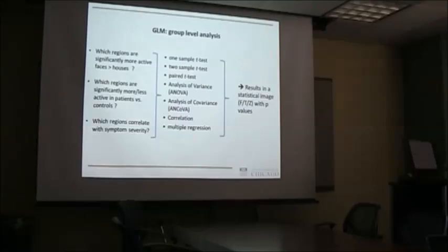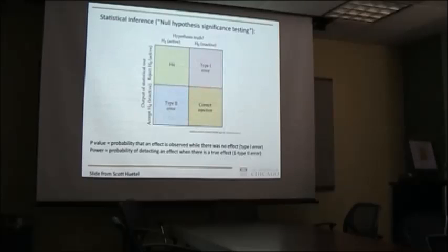And each of the test statistics have their own distribution, and they're related to p-values. Right? So regardless of the exact nature of your analysis, this will always be your output, right? The thing that SPM or any other package will generate. And I want to talk about p-values a little bit more because it's somewhat of a tricky issue in fMRI.